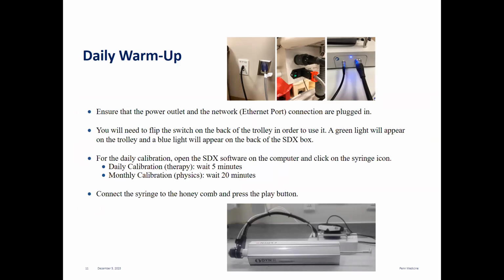Next, you will need to flip the switch on the back of the cart and turn it on to use it. Once the switch is flipped to the on position, a light will turn green on the actual cart. Once it is on, the blue light will appear on the back of the SDX box as pictured.